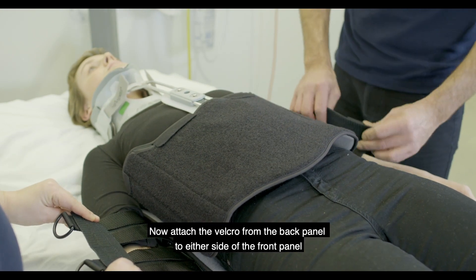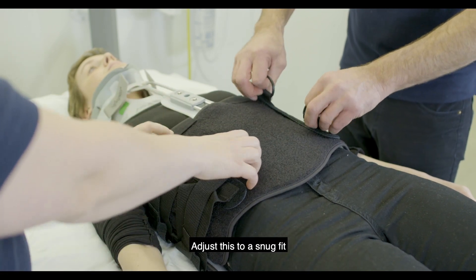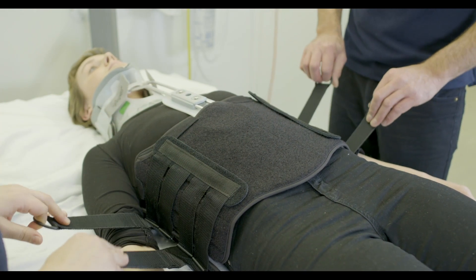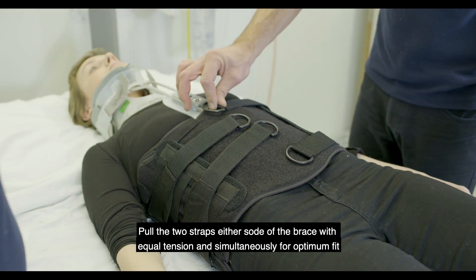Now attach the velcro from the back panel to either side of the front panel. Adjust this to a snug fit. Pull the two straps either side of the brace with equal tension and simultaneously for optimum fit.